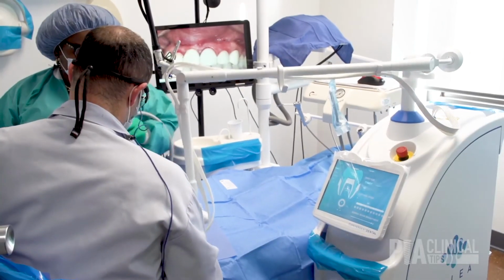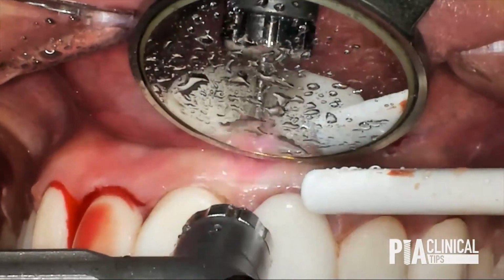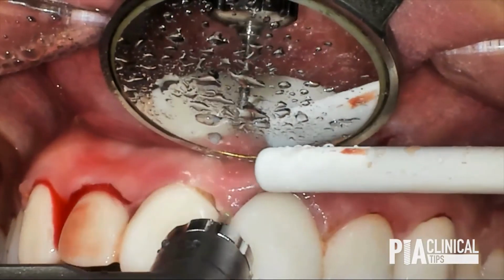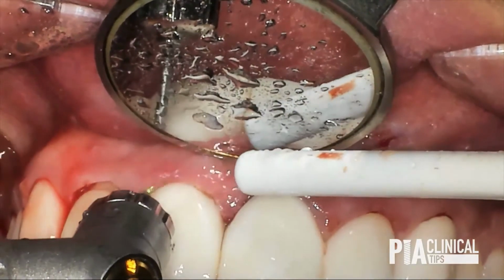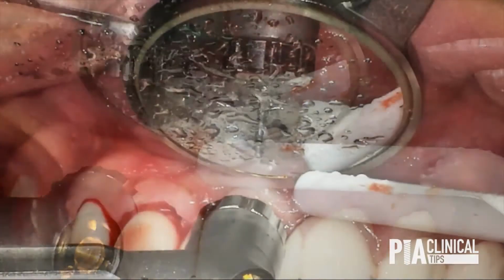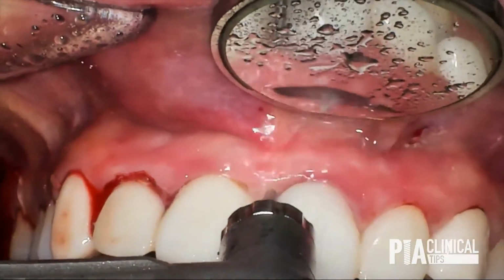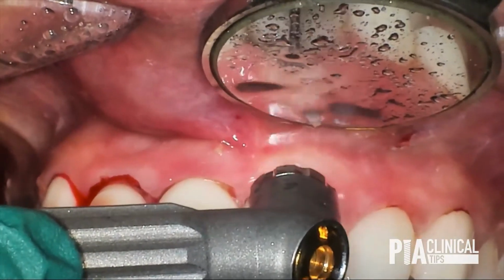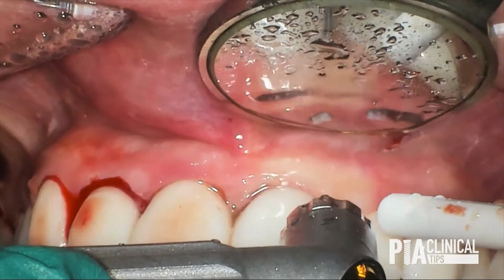So this is the Solea machine, the 9.3 micron CO2 laser, and as you can see here, we are beginning to do our functional crown lengthening with an ultra guide handpiece, which is an insert into the laser hollow waveguide tube, and it helps us perform both soft and hard tissue crown lengthening. As you can see here, we are making sweeping motions with that hollow waveguide in a closed flap manner, reducing the soft tissue architecture, creating positive architecture of both the bone and the soft tissue.